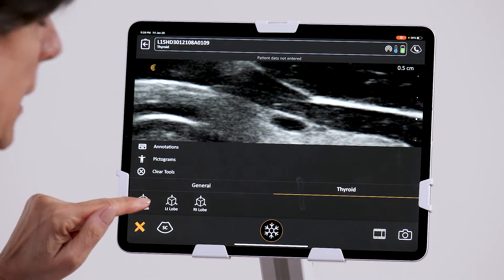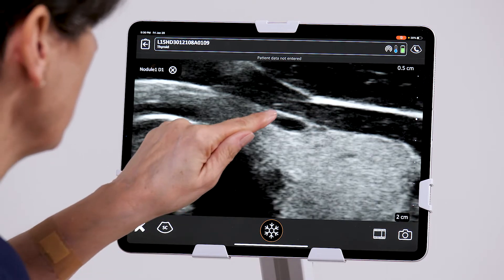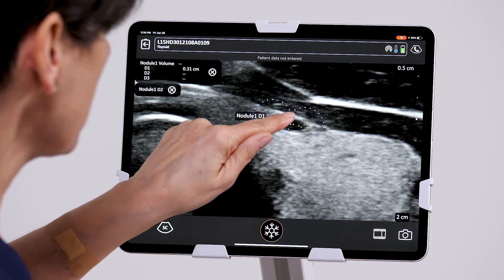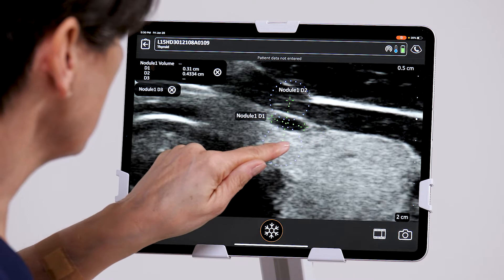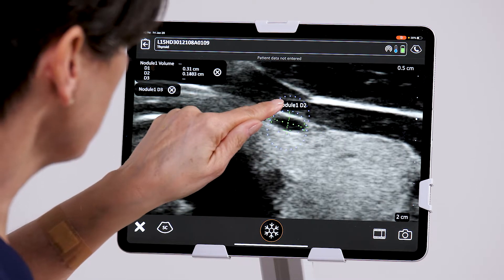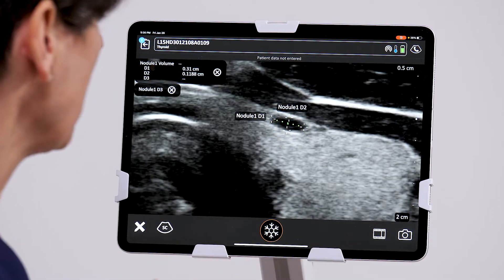Here we can select nodule, place our calipers, and take an image.